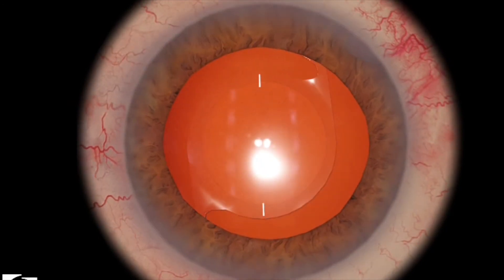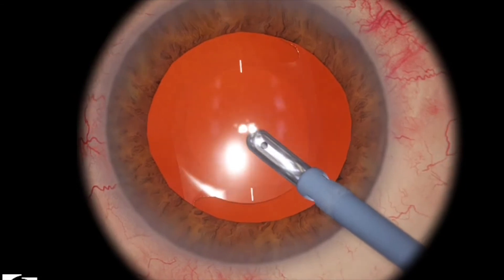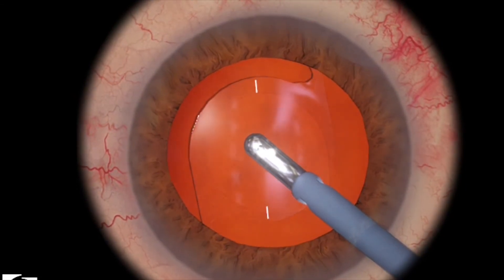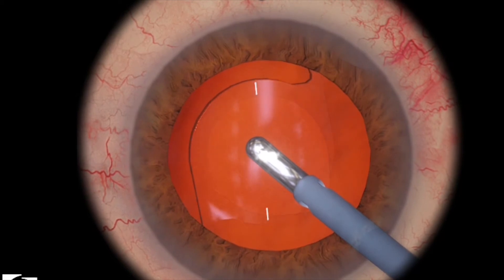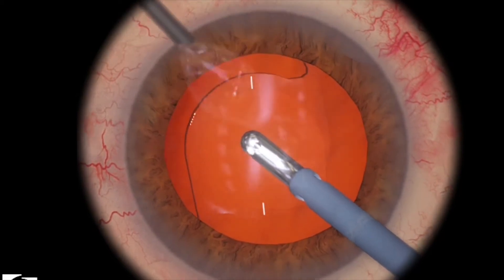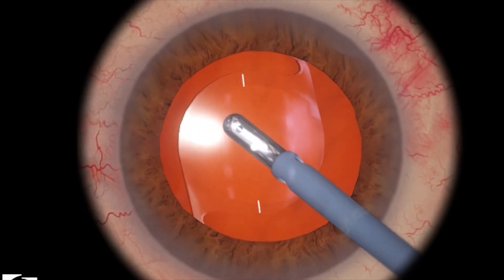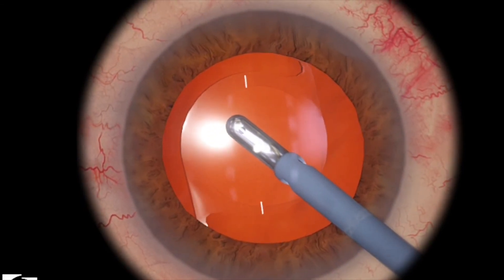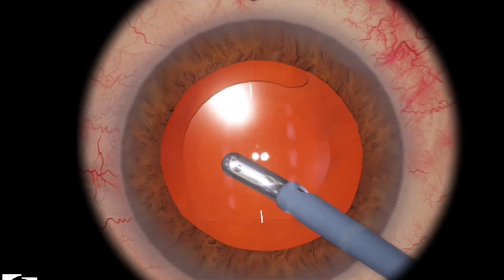Now the markers are aligned. Take your instrument out and put in your IA handpiece. Use a rock and roll technique. You'll notice that the viscoelastic is coming to me. I'm setting the vacuum setting a little bit higher when doing this compared to the IA regular settings in the OR machine.